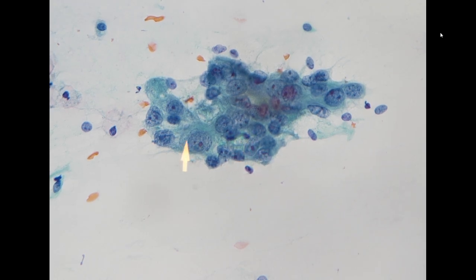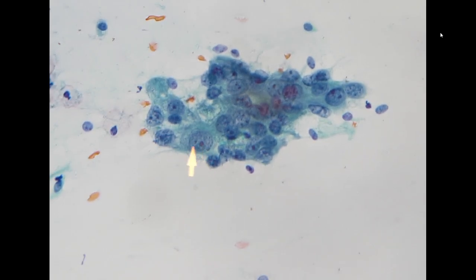It does show a little bit of cytoplasmic process, but it is not as obvious as what we usually see for repair, where the cytoplasm is usually more rigid and more dense, and the process is usually more obvious. And then you see that the cell has a prominent nucleolus. Prominent nucleolus also occurs in repair cells, so it doesn't argue against repair.